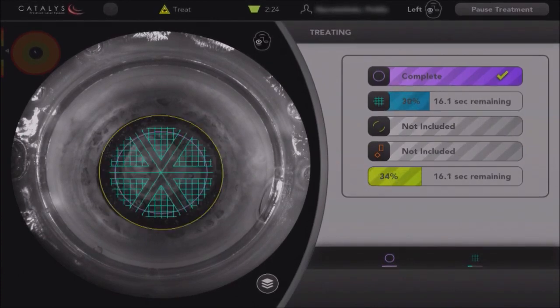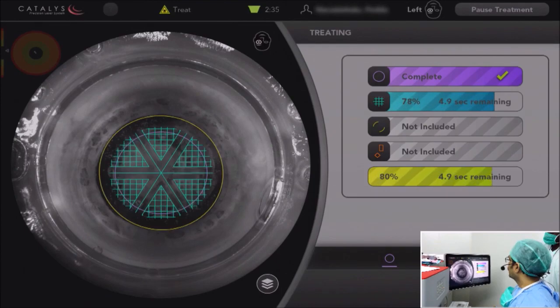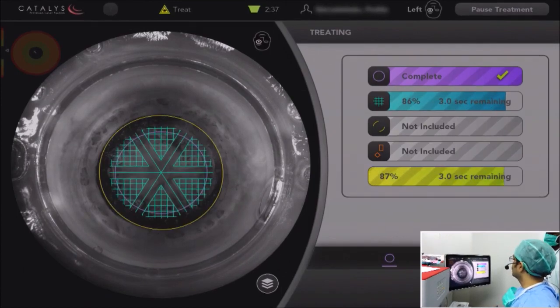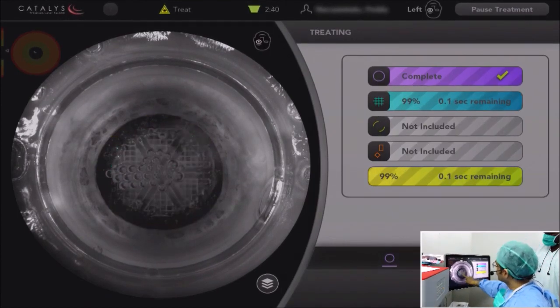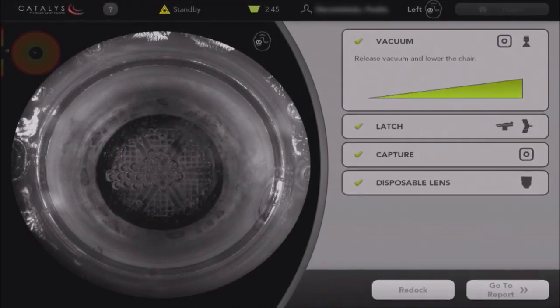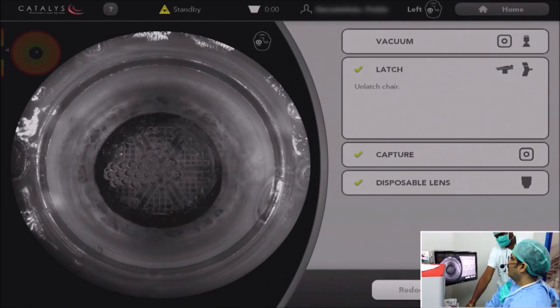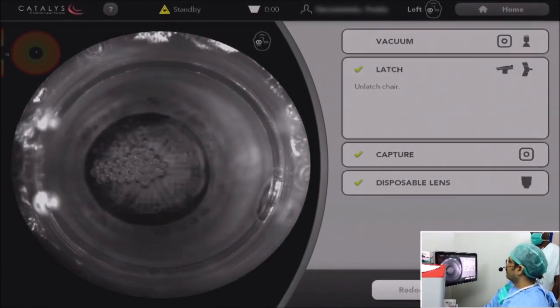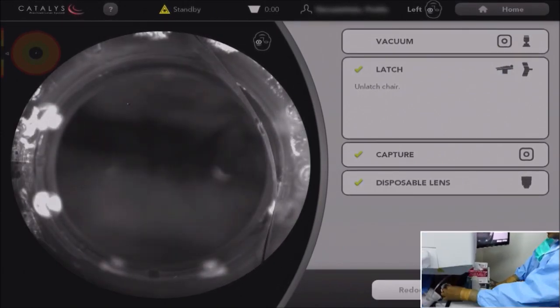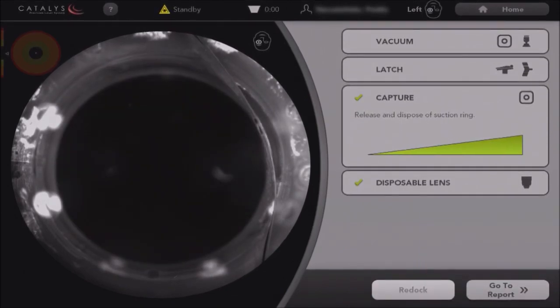The laser fragmentation is being done. I made six sextant pieces, and then each piece is again divided into small cubicles. Each cubicle will be easily removed. You can see the cavitation bubbles came through the capsulotomy margin. Now the procedure is done. I am releasing the vacuum and reducing the height of the table. The table is released from the machine.